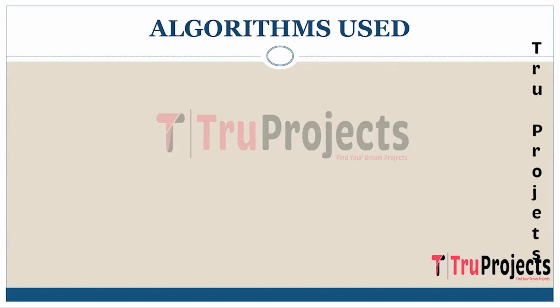Algorithms used in the project are CNN. It is a convolutional neural network. It is a deep learning model that is designed for processing structured grid data such as images. CNNs employ convolutional layers to automatically learn features from the input data, making them highly effective in tasks like image classification, object detection, and segmentation.